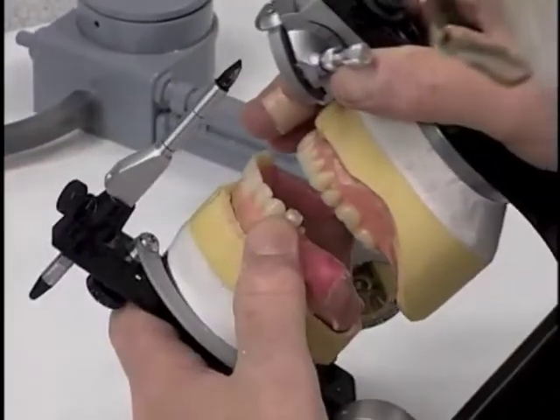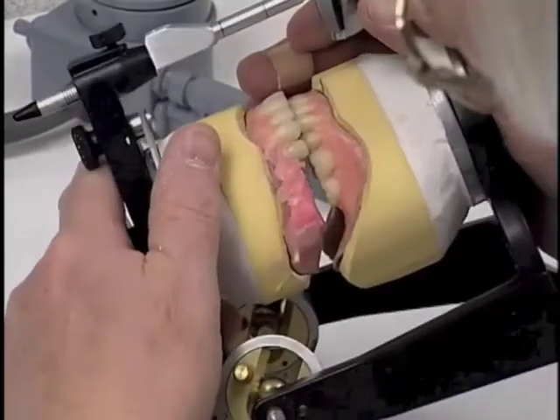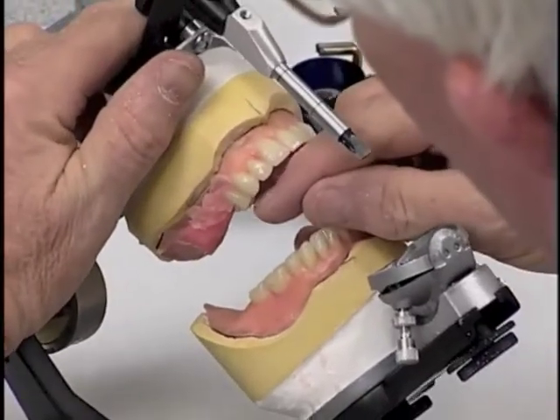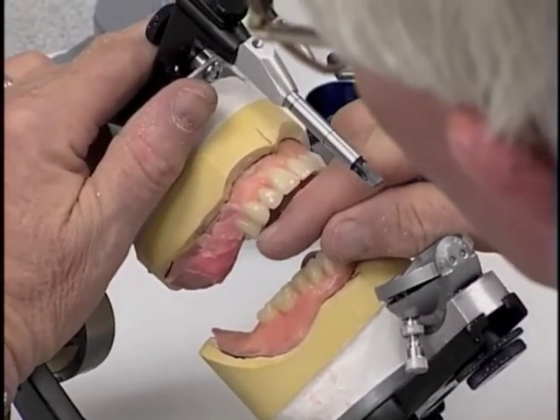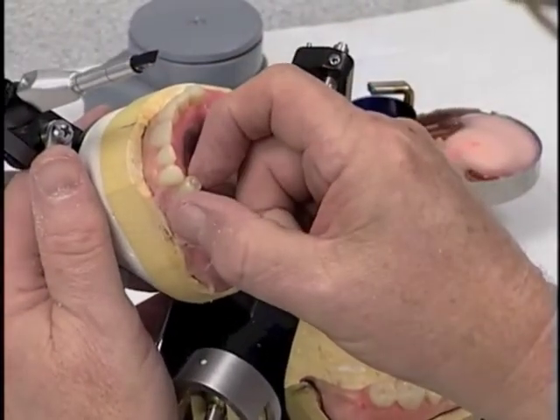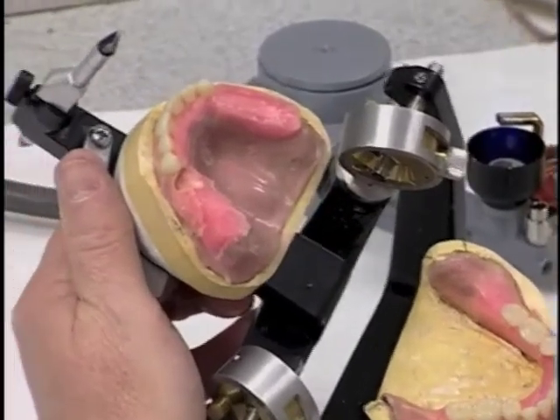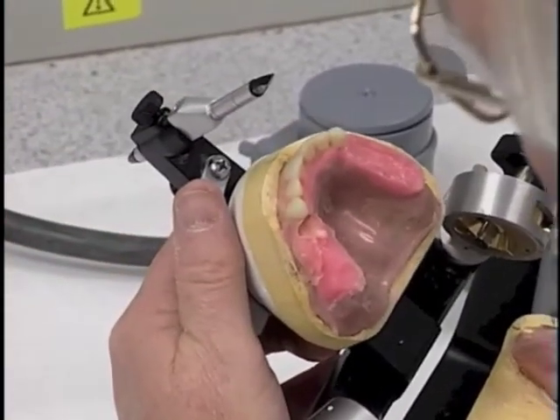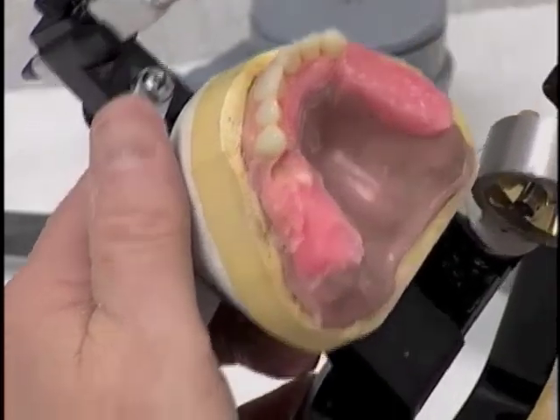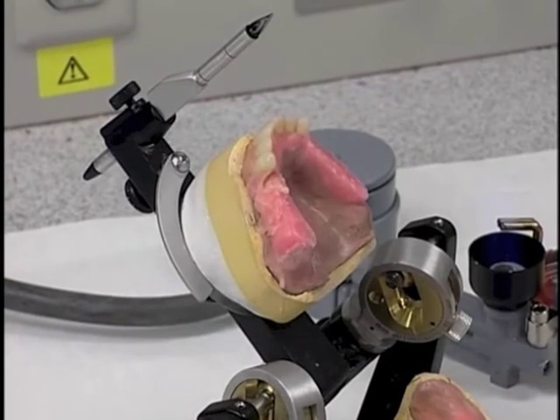Now let's see what we can do now. There we go. Except the tooth is not flat. As I'm looking at it now, I'm seeing that the lingual cusp is up too far and the buccal cusp is hanging down, which means that we probably still have a little bit of interference. So let's remove the tooth and see. No, I don't see an interference from the tooth. Yes, I do, just a little bit. Right there. There's just a tiny bit of interference. So I'm going to be doing a little bit more trimming.